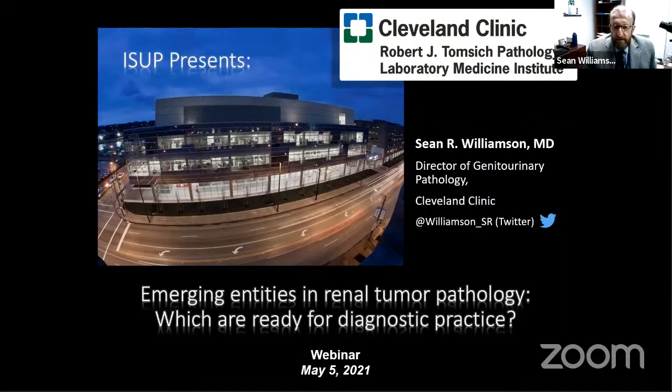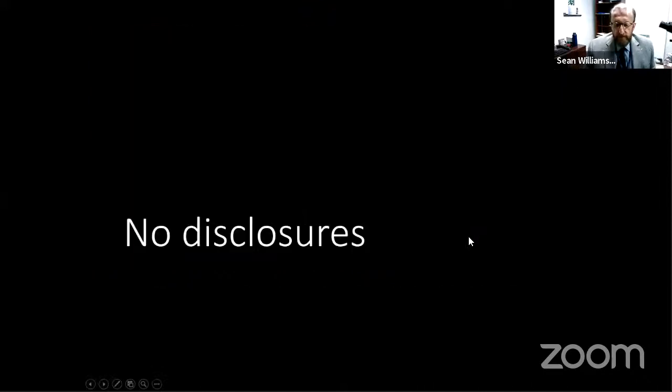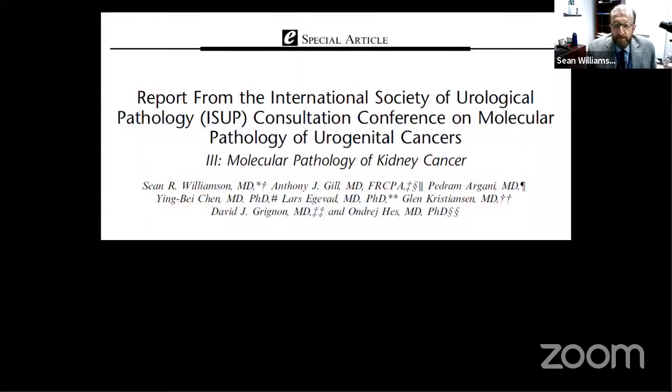So I'd like to talk about a topic that's one of my favorite aspects of GU pathology, and that's emerging entities in renal tumor pathology. I have no disclosures relevant to this presentation.